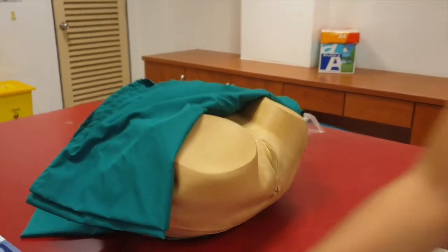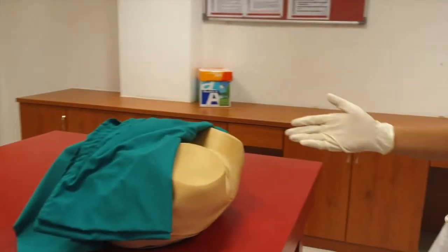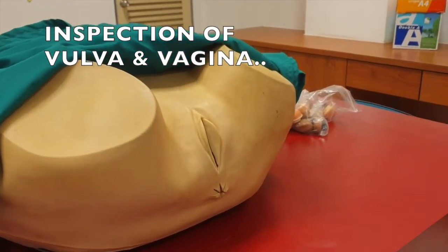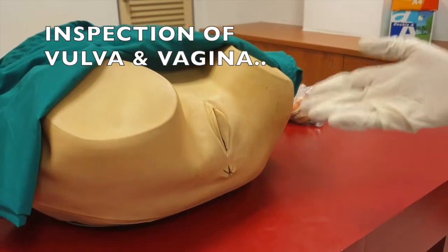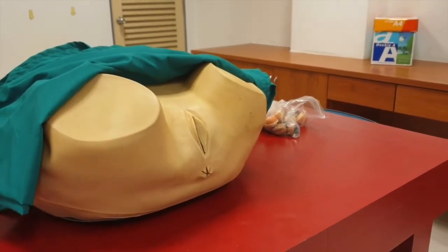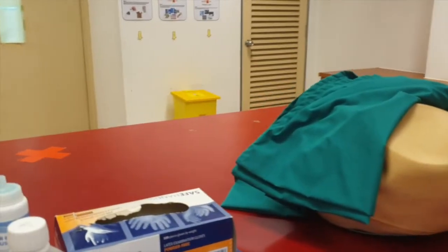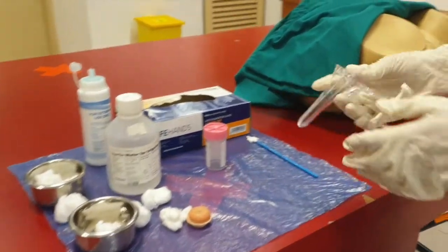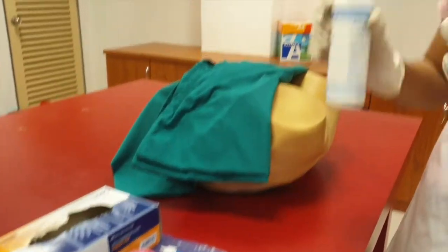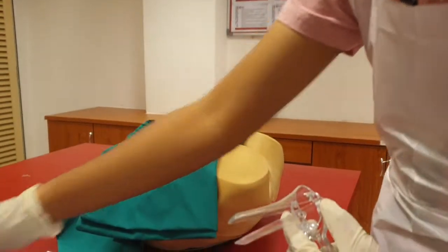Once it is clean, we inspect the perineal region, the vulva, for any obvious abnormalities, any bleeding, any discharge, or any visible masses. Then we will proceed with the insertion of the speculum. Take a speculum and put some lubricating gel. This is to smoothen and ease the procedure.